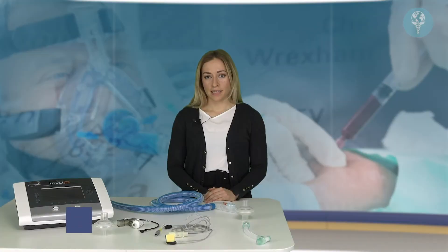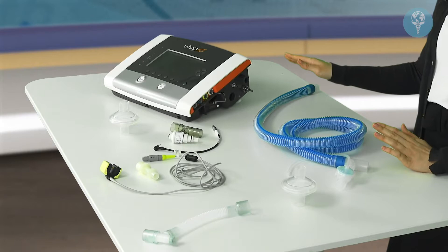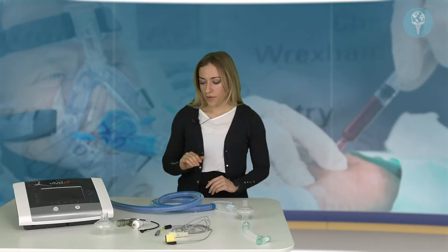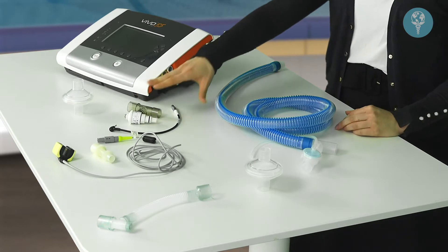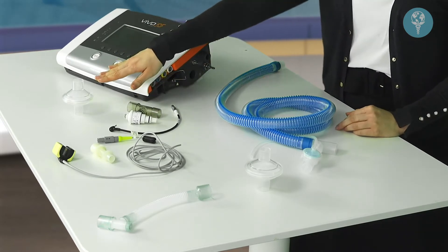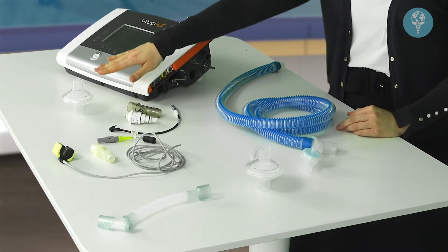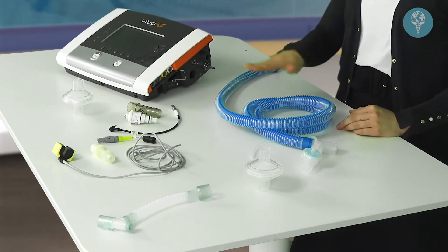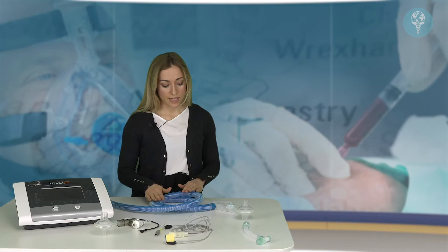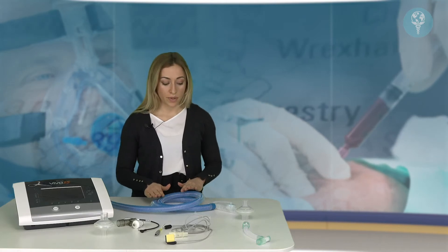In this video we're going to cover the setup of the active exhalation valve circuit for invasive use with the Vivo 55. First we would set up the FiO2 sensor, then we need an antibacterial filter which connects between the FiO2 sensor and the patient circuit. This is the active exhalation valve circuit used with the Vivo 55.